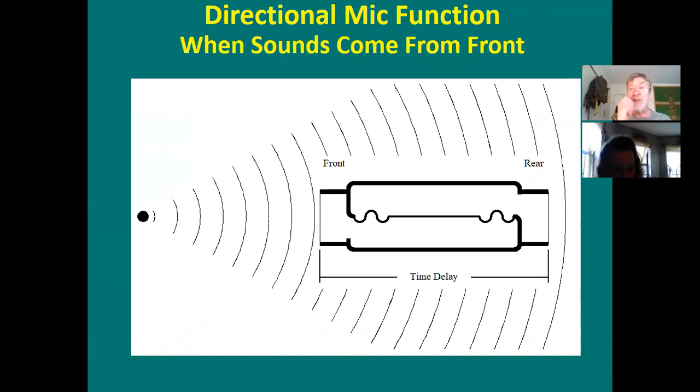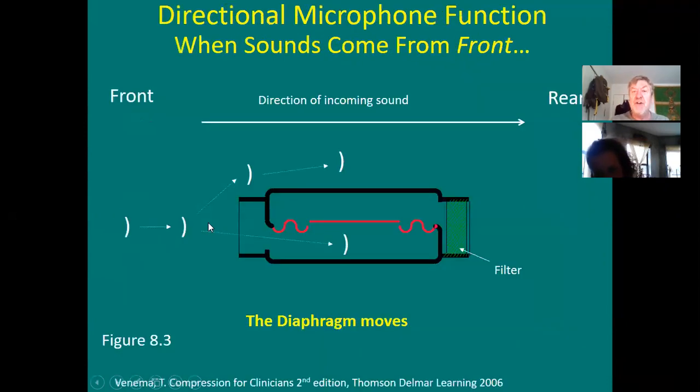Directional microphone, when sound comes from the front. So here's a D mic now. Look closely at how it has a front door and a back door. Okay? So now sound is coming from the front, and it's going to enter the front door.